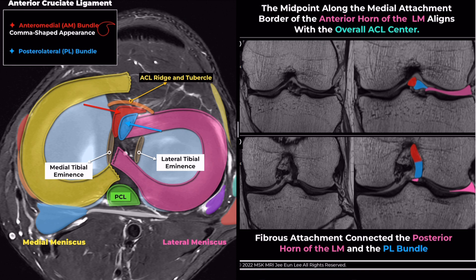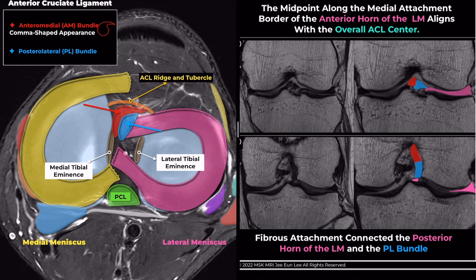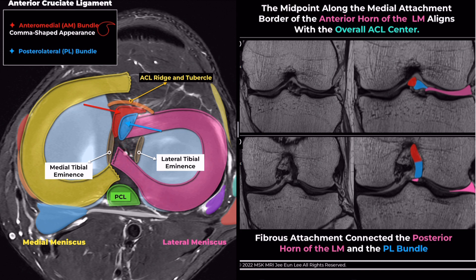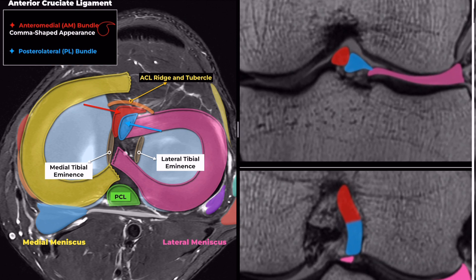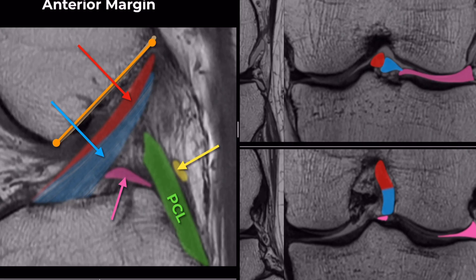Looking at a more posterior coronal image, the posterior root of the lateral meniscus mainly attaches to the intertubercular area, with a thin, long ventral extension reaching just posteromedial to the tibial attachment of the ACL. Thus, the fibrous attachment between the posterior root of the lateral meniscus and the posterolateral bundle of the ACL is clearly visible due to their close proximity.